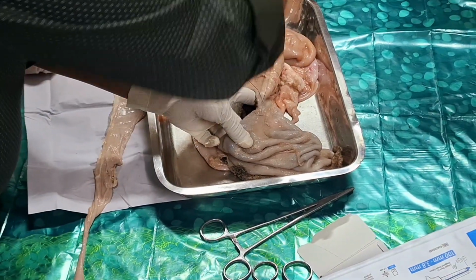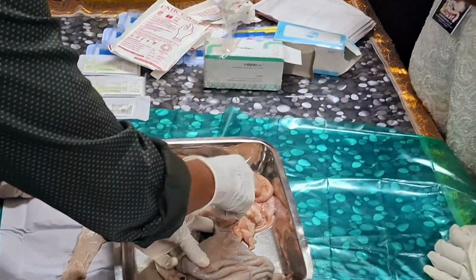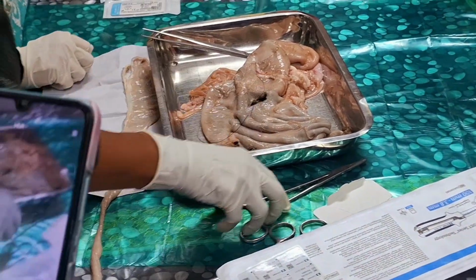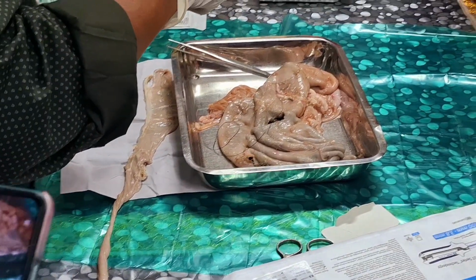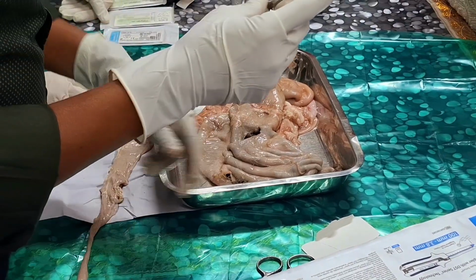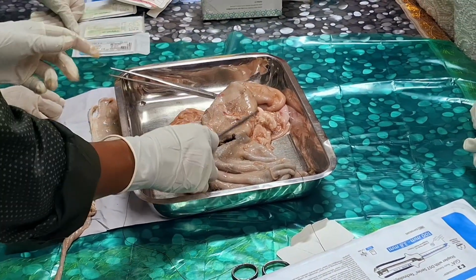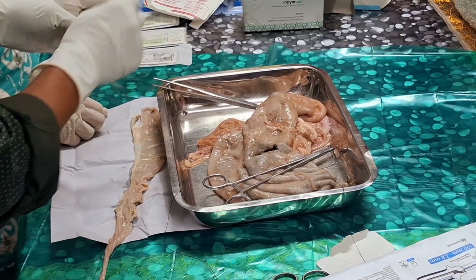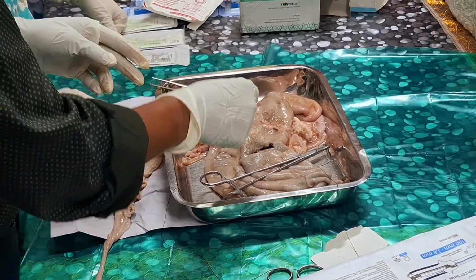There will be corners. I told you, corners. Corner stitch is otherwise called a continuous U-shaped stitch that we will take in the corners to prevent mucosal eversion, so that you can prevent... corners of the... We will use two volunteers to demonstrate the corner stitch.